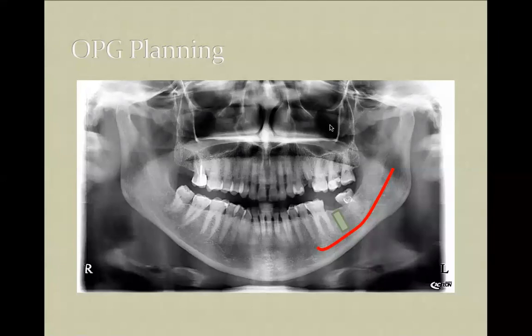If you look at this picture, here we have the site of adentia, and here I already placed a virtual dental implant, so it might be placed easily. It is not necessary to do any additional procedures. I don't remember this patient, but I think there was no problem with the gingiva, so it will be very easy to place an implant here.